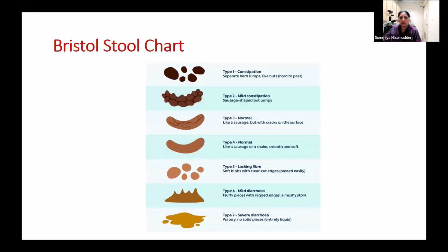So this is a Bristol stool chart. इसमें अगर टाइप 6 और टाइप 7 का स्टूल अगर पेशेंट्स पास कर रहे हैं तो दैट्स वेयर जो है आप कल्चर्स के लिए भिजवाएं सैम्पल, वरना टाइप 5 एंड अपवर्ड्स जो है फ़ायदा नहीं है उनका कल्चर्स में भिजवाने के लिए. सो टाइप 6 एंड टाइप 7 हो तो आप बैक्टीरियल कल्चर के लिए भिजवाएं एंड फॉर सी डिफ.